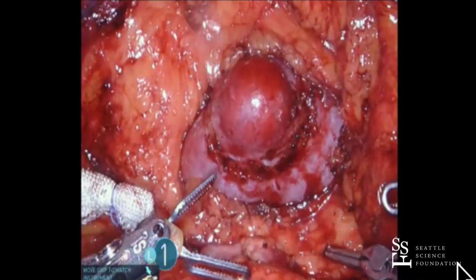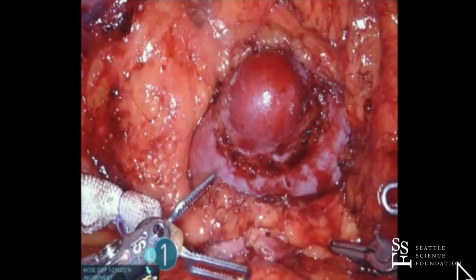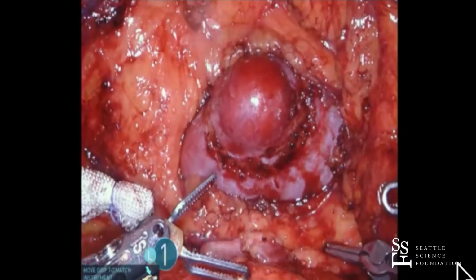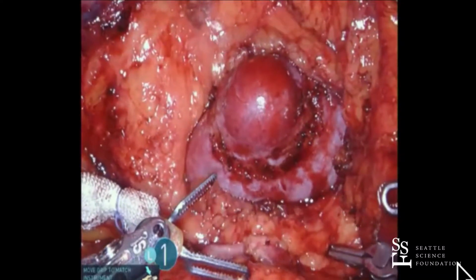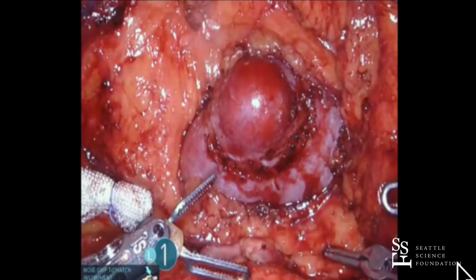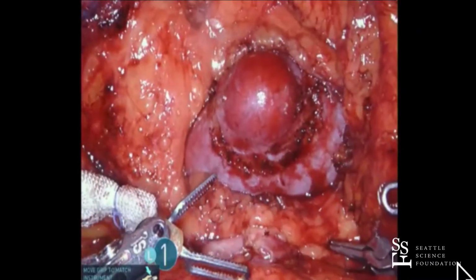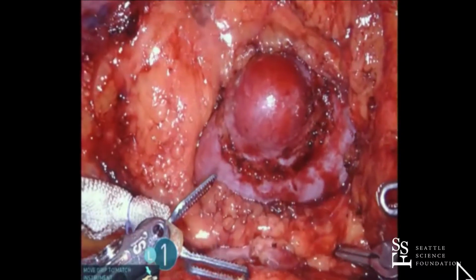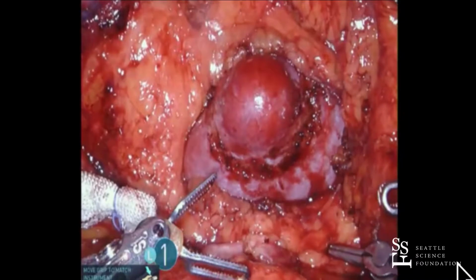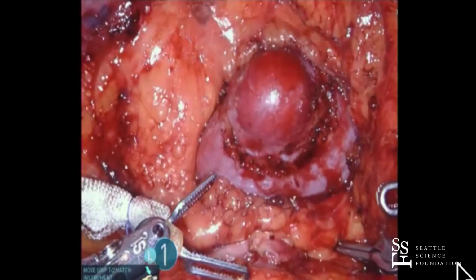I'll do early unclamping in most cases. I mean, if the warm ischemia time is like 9 minutes or whatever, I'll just continue the case. There's no point in doing early unclamping because in general, I get all the vessels. I mean, I would say not in general, but I get all the vessels with my individual sutures. So I'll do early unclamping in most cases, but if it's a short ischemia time, it doesn't matter, then I just finish it. So that's my plan.